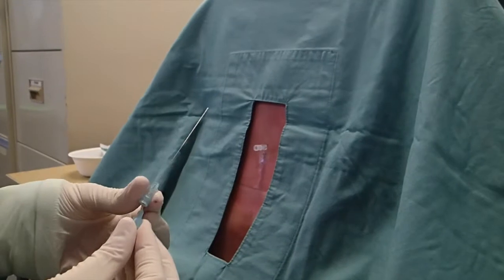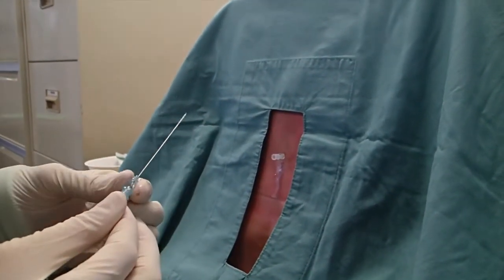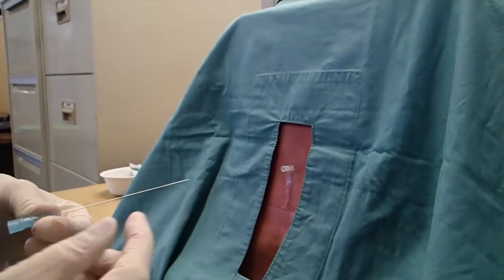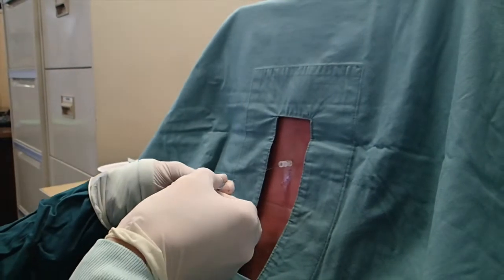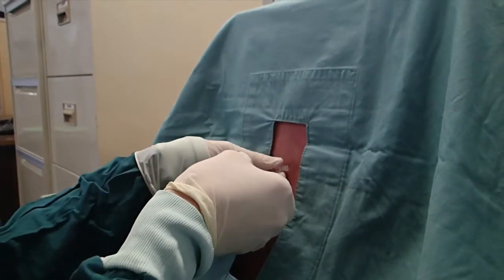Now we're going to put in our 25 gauge Whitacre needle and line it all up. As you can see, the tip is a pencil point and it has a bevel which I'm going to face upwards, which is in line with this little groove here. Now this is going to go into my introducer, which just helps me guide where the needle goes because it's a very thin little needle.